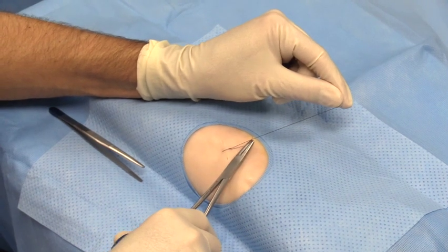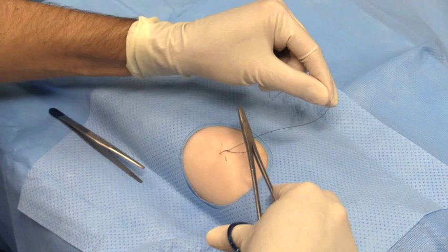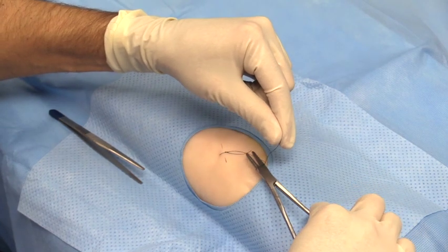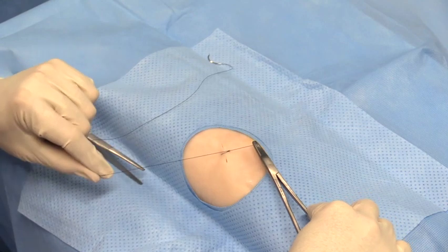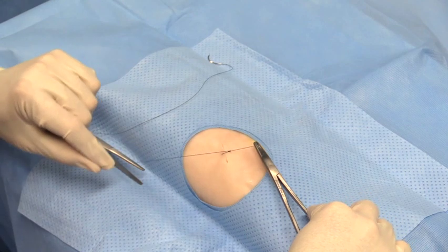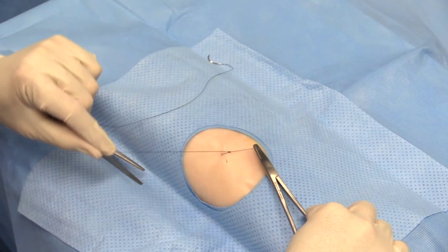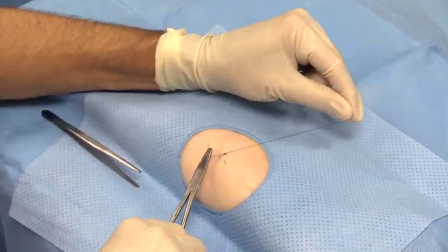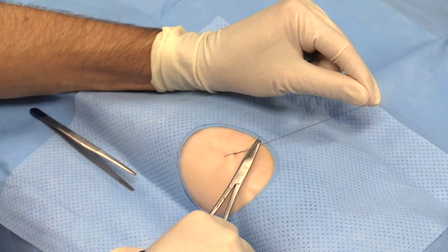Now repeat this process by placing the needle holders between the wound and the long end of the suture. Wind the suture over the needle holders, this time doing 1 revolution. Pull the suture firmly. Again, the ends should swap sides. Repeat this process again. Position the knot away from the wound so it won't interrupt any wound healing.